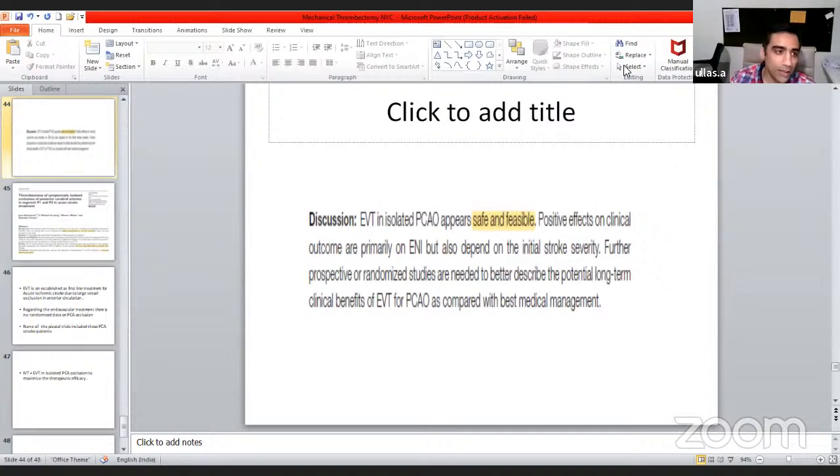So usually they come up delayed, but when they come up and if they have hemiparesis, remember that it could be proximal posterior cerebral artery occlusion, which can be taken up for mechanical thrombectomy because we have special devices or smaller devices to go into these branches and remove them effectively and safely. Thank you.